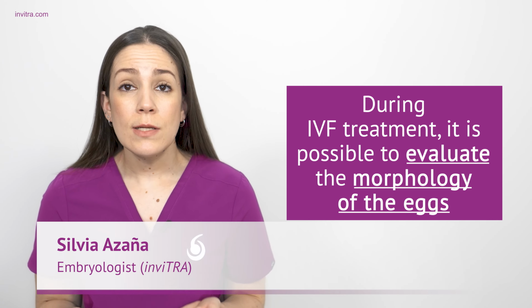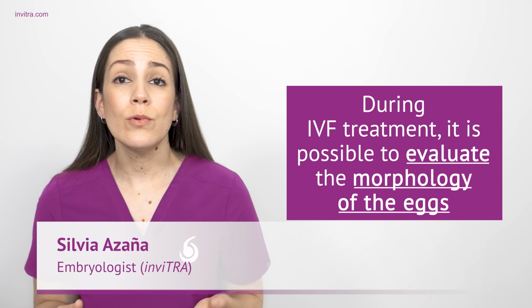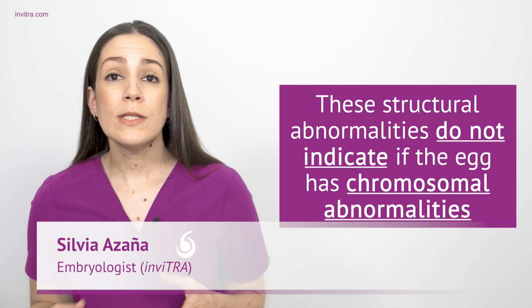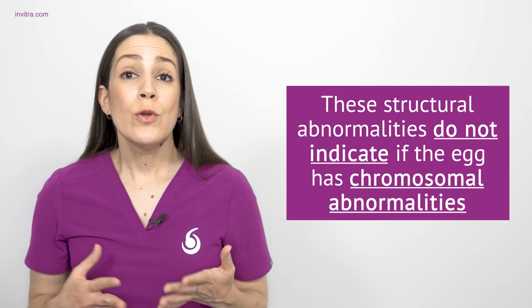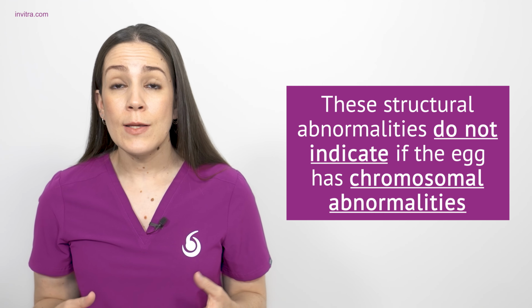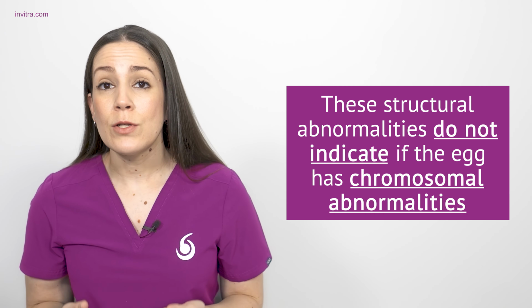Determining egg quality is not a simple task. Nevertheless, during IVF treatment, it is possible to evaluate the morphology of the eggs through a microscope. However, these structural alterations that can be observed under the microscope do not indicate or provide information initially about whether the egg has chromosomal alterations or not.